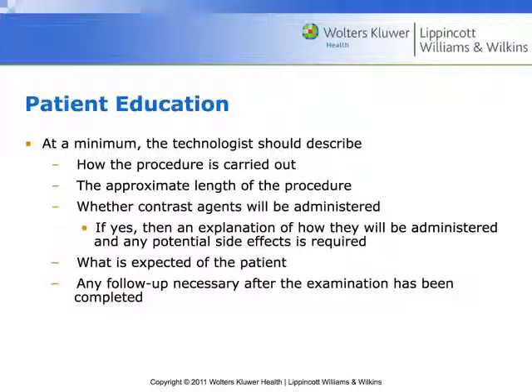And then, of course, as soon as they get off the table, they're going to want to know what happens next, right? We'll have results in 30 minutes. We'll have results tomorrow, right? If I'm not really busy, I might allow them, if they're interested. When I worked at the cancer treatment place, we did this a lot. I would allow them to look at the images with me. I would say, we've got some time. If you want, I can show you the pictures. I'm not a doctor, but we can look at the pictures together.